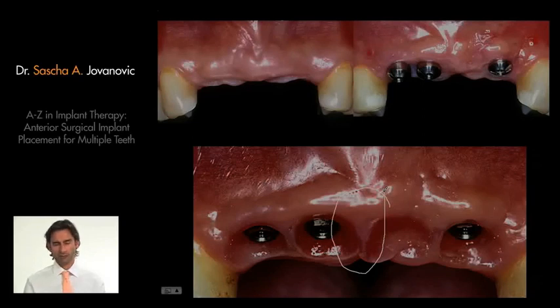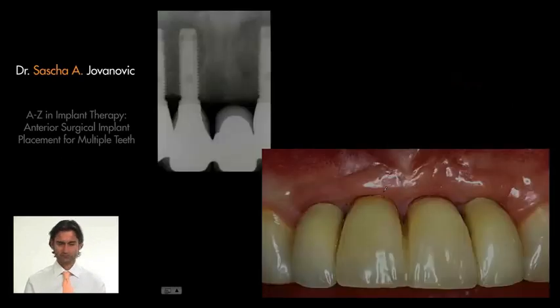Yes, it is important for these kind of cases for the ovate pontic to create soft tissue. So here often we have to utilize some soft tissue graft to augment the site, to plump it out. And then we can place the pontic right into the site as an ovate pontic to push it out. But here you can see the keratinized tissue maintenance and the soft tissue maintenance.